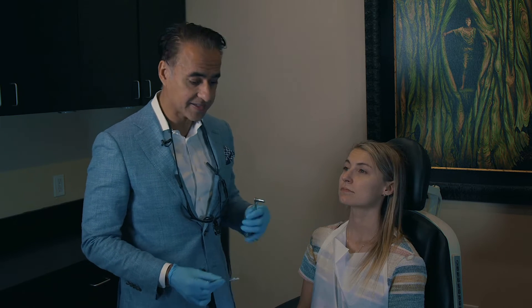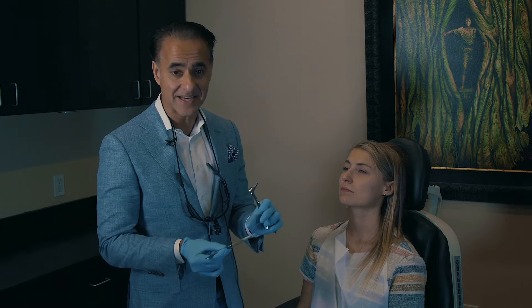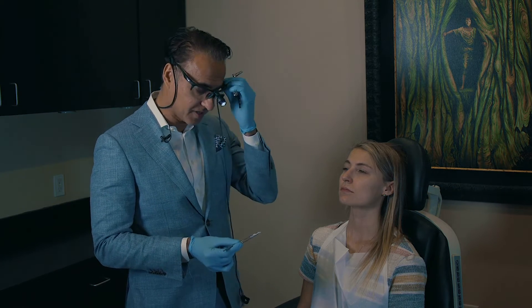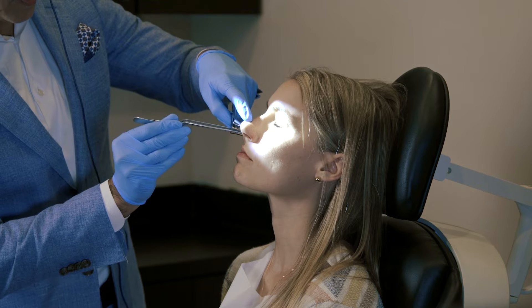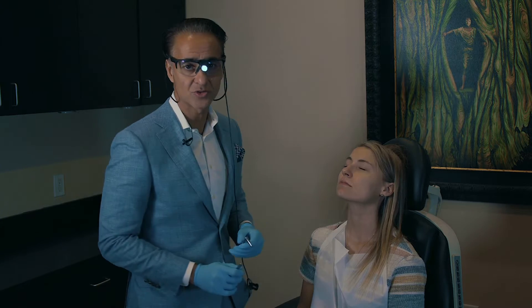After we spray her nose, the second step is to place a piece of cotton that has numbing medication. This is where 99% of the numbing occurs — with this topical numbing medication. We're just going to lay it in there, right in the front, and have her sit for about 20 minutes.